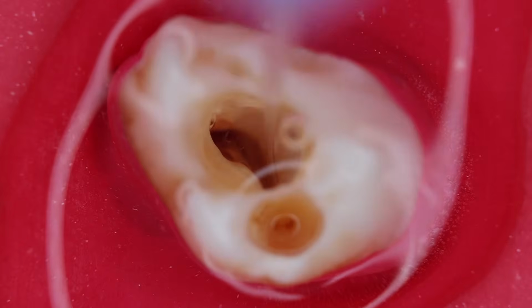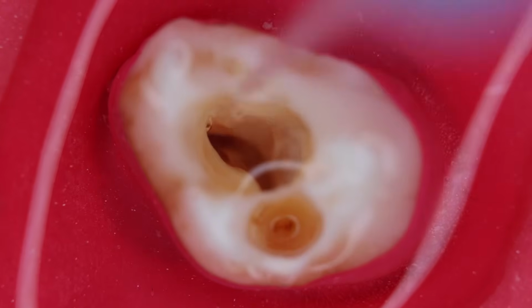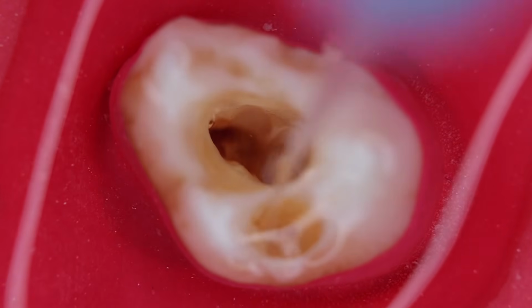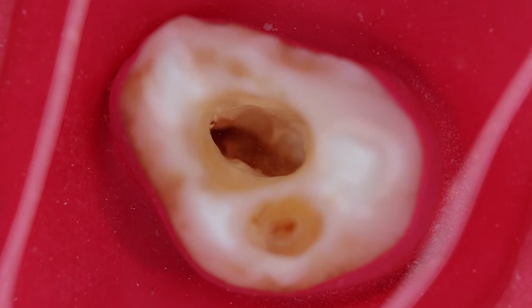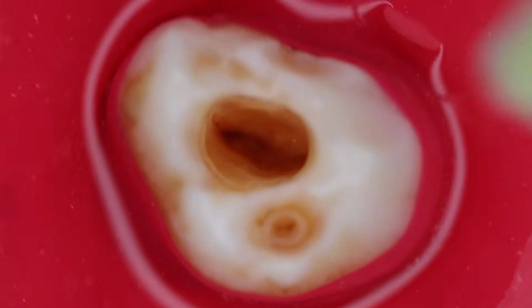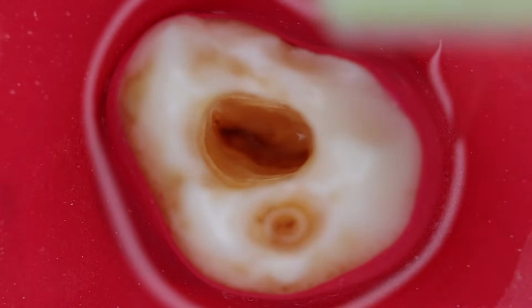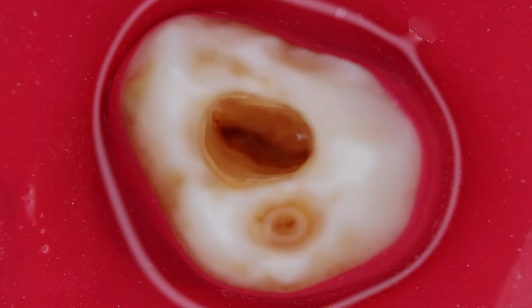It should not be kept from the bottle and then used. Irrigate these canal orifices. And once you have irrigated, do not blow air directly into it. You should be blowing it horizontally. Otherwise you can suck the irrigant.